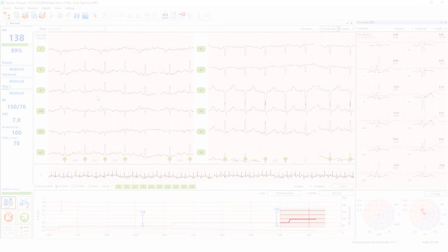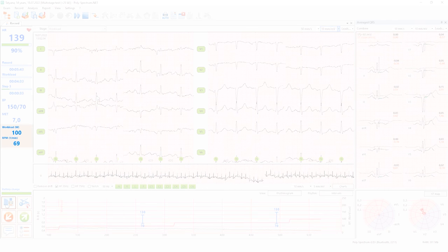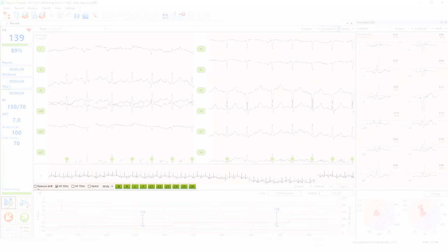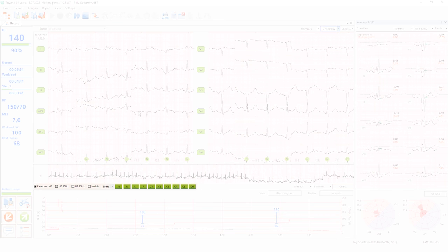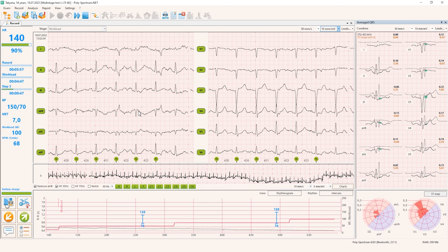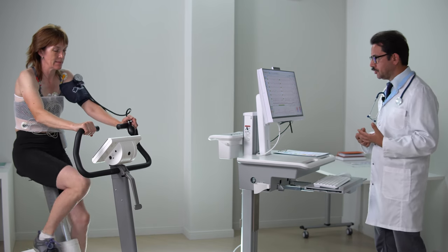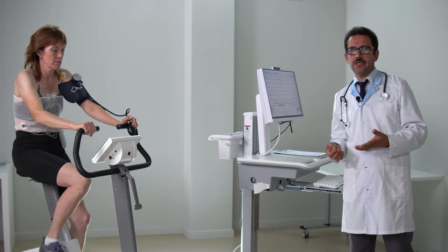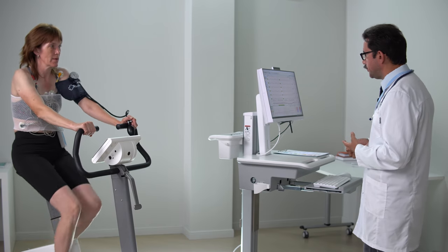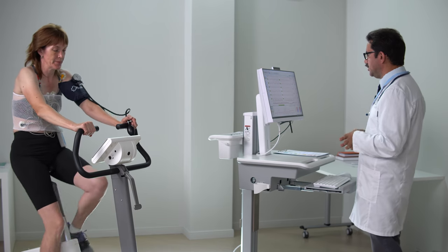Anyway, now we are on the third step with 100 watts. It's quite a good workload for our patient. I can now activate the drift filter, because you know that the less filtering you use during the test, the better actually. Good news that the Polyspectrum software saves unfiltered data too, so you can check how the data looks after the recording without switching the filter on or off. But better you see the native ECG.